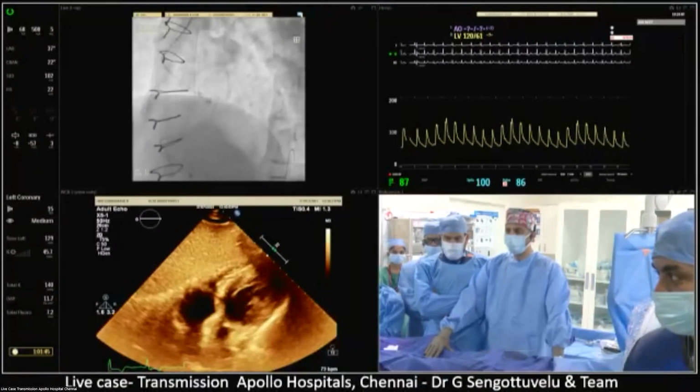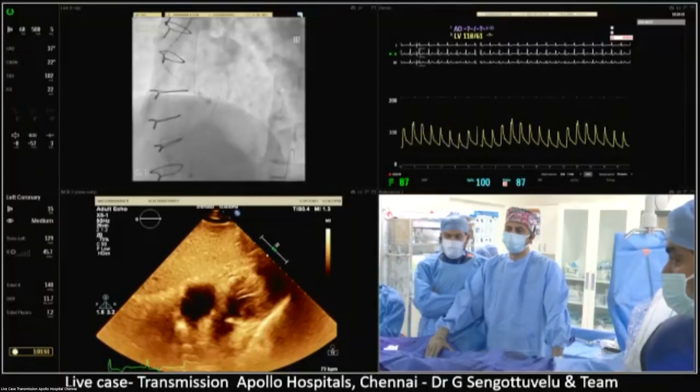You know, in bicuspids in general, I'm always concerned. If you look at the data behind it, even though multiple registries show similar outcomes, having done hundreds and thousands of these, our experience is that bicuspids in general are a little less favorable. Yeah, that's fine.